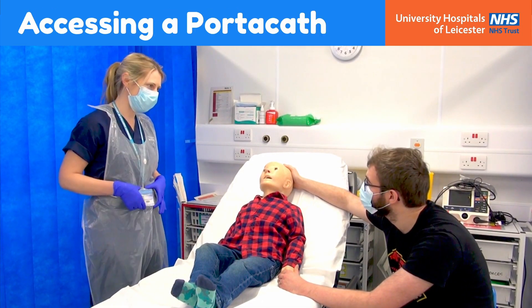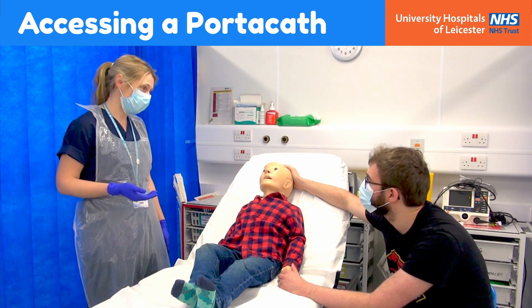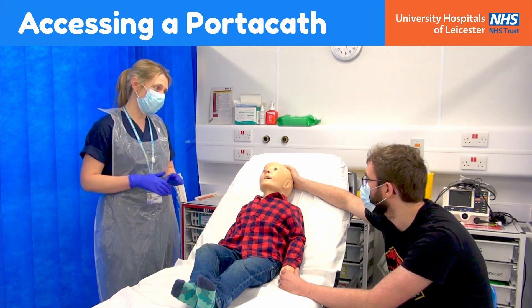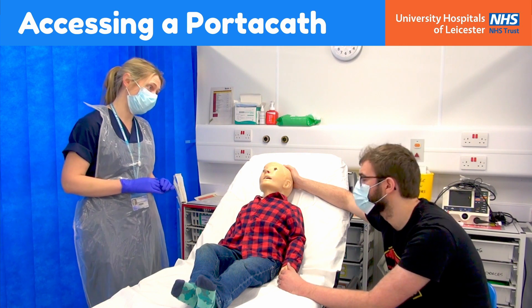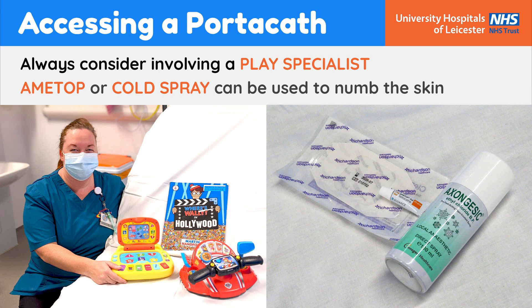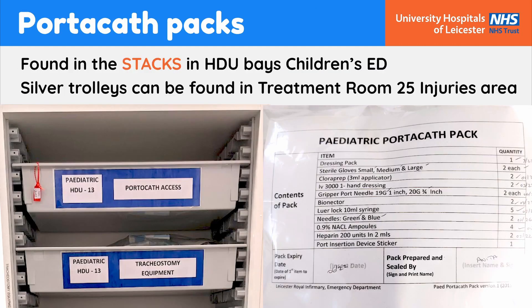When preparing to access a portacath, start by introducing yourself to the patient and checking their identity. Explain the reasons for accessing their device and ensure you have valid consent to do so. Ask which size portacath needle they normally use and if their portacath has a single or double lumen, since in double lumen devices both must be accessed and flushed. Please involve the play specialists and ask the child and parent if they wish to use amitop or cold spray to help numb the skin.